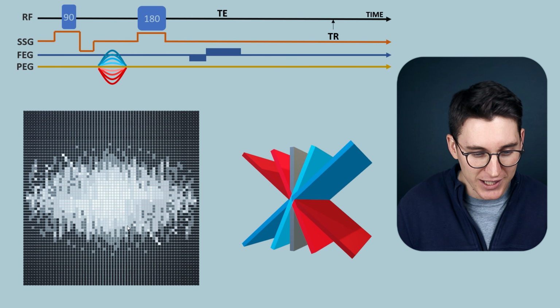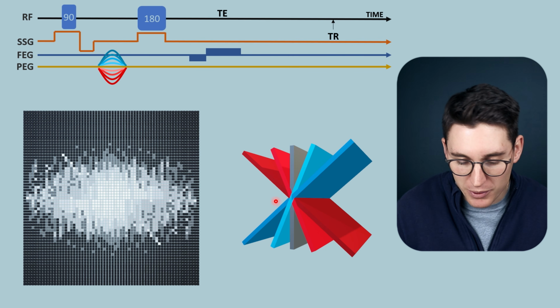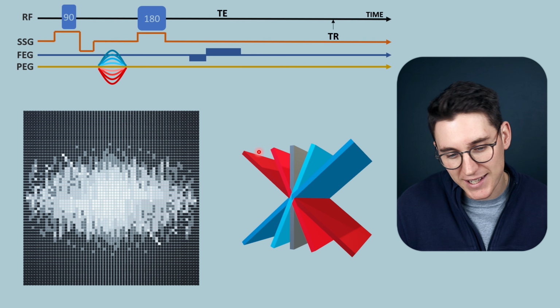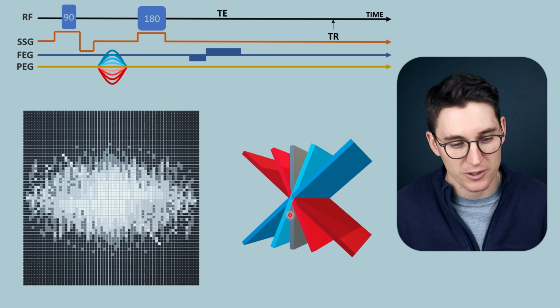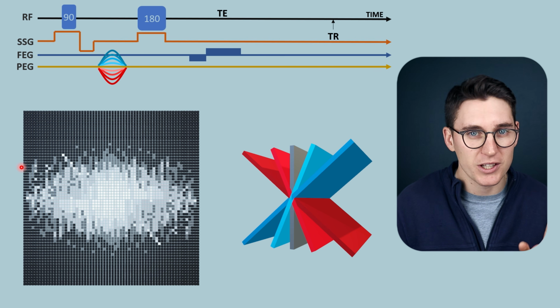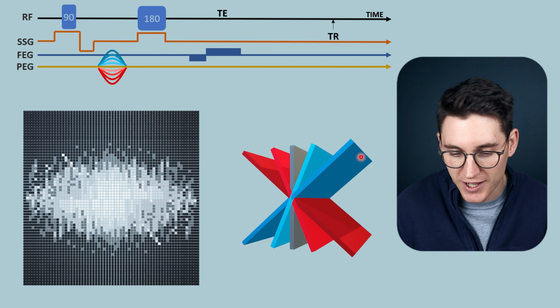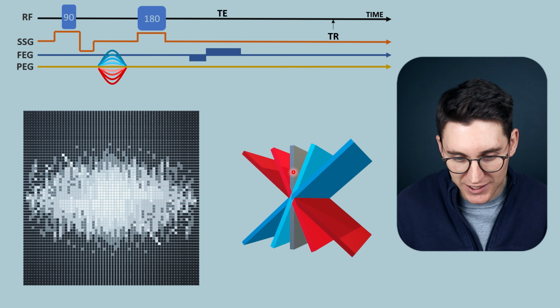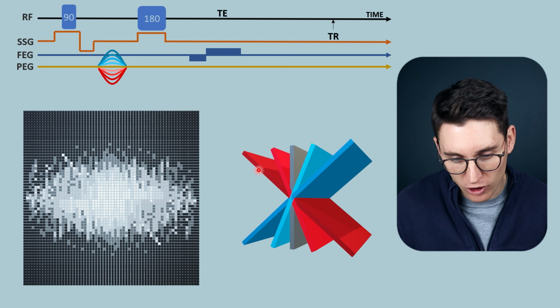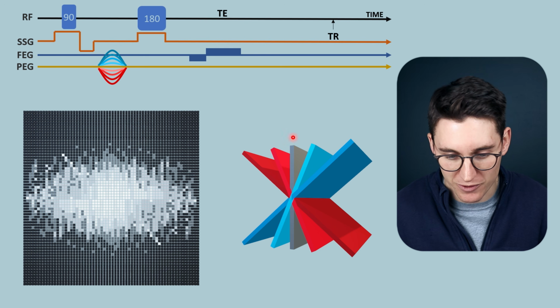Now, with that being said, if we look at K-space itself and we apply phase encoding gradients that increase in degree as we apply stronger and stronger phase encoding gradients, we can see that there are certain phase encoding gradients that have an equal and opposite phase encoding gradient. So this line of data that we acquire here at a specific phase encoding gradient should, in theory, have an equal and opposite phase encoding gradient along the y-axis here, if you take dark red and dark blue here. As you can see, a specific spin at a specific location on this y-axis will experience an equal and opposite phase encoding along that y-axis data point, depending on the direction of that gradient that we have applied.